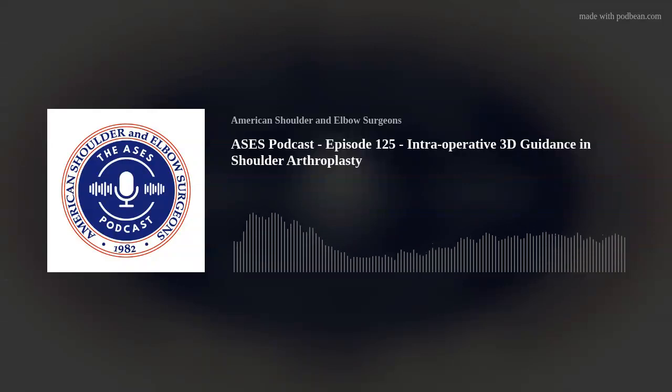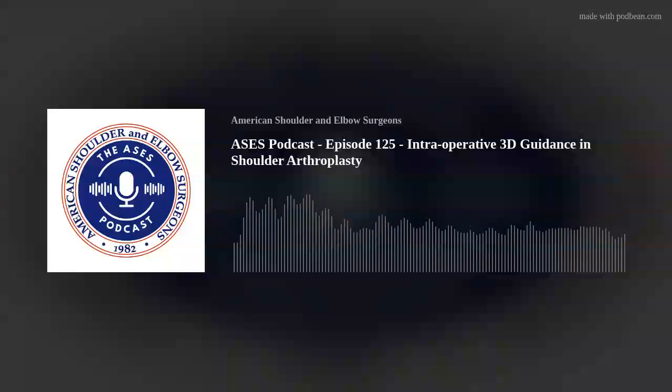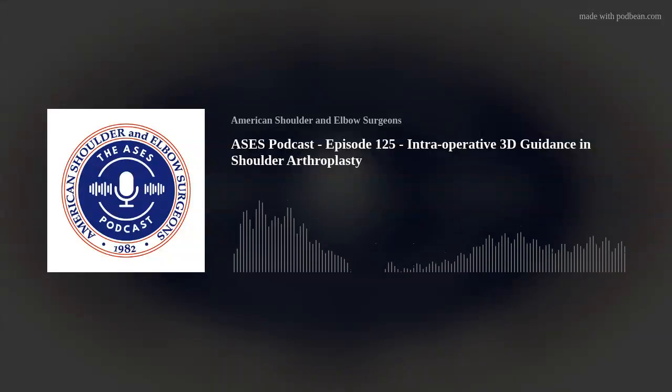and it'll be nice to be able to execute accurately. And for me, at the moment, pretty much every single case I'm using patient-specific instrumentation, so PSI guides. I have a bio-RSA preparation with part of my shoulder arthroplasty system that also allows me to prepare the graft perfectly as per my preoperative plan. In fact, the PSI print also has the bio-RSA graft to check with that. So my intraoperative execution is all done PSI.